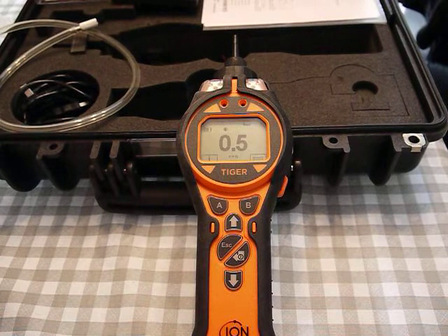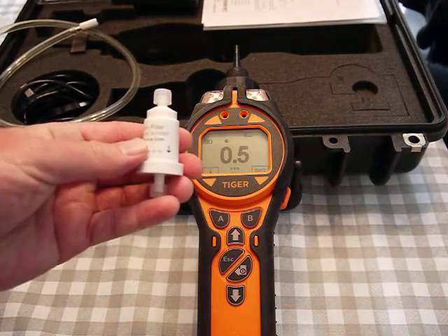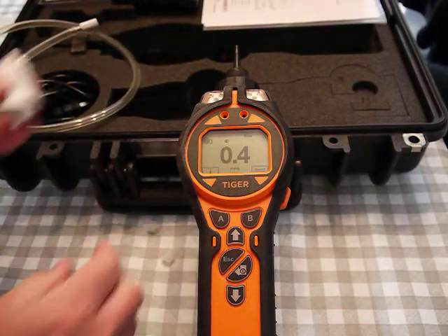The first step for calibration: you can either zero using clean air if you know the room has no VOCs, or you can use this carbon filter that's included. It's got two little caps on either end.